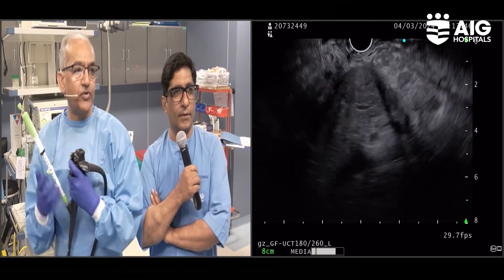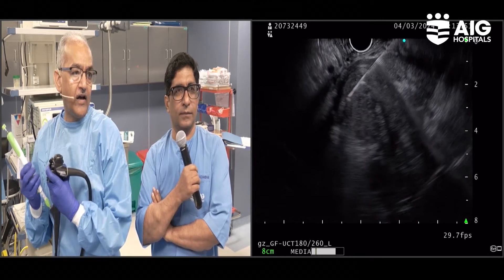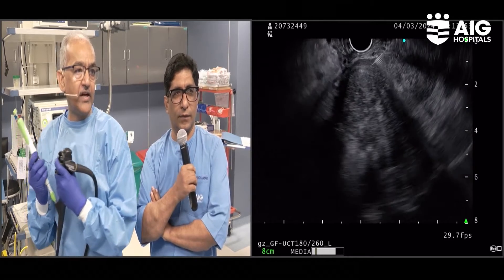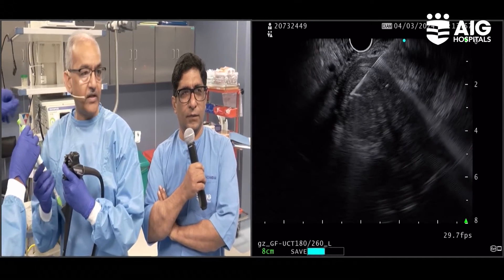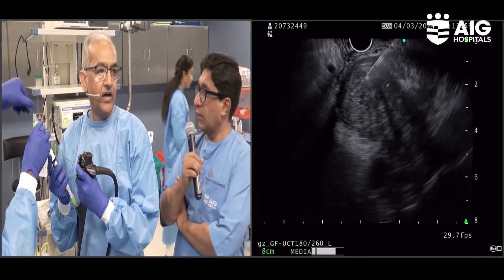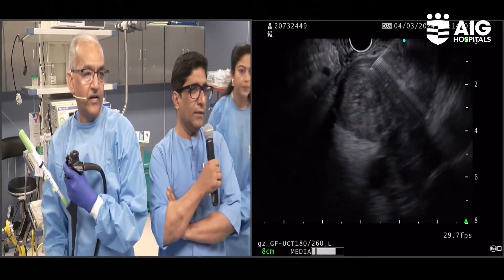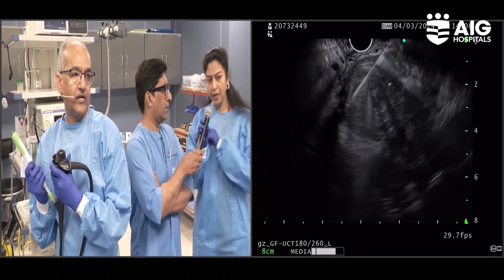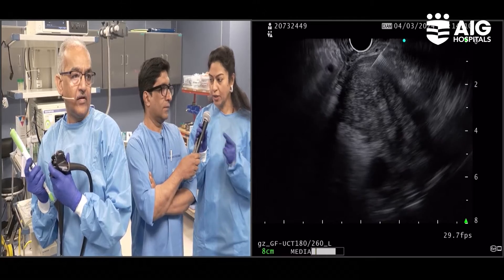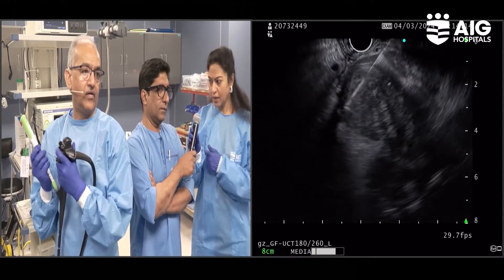Currently, pathologists have to come to the endoscopy room with the microscope and all the paraphernalia. So that's the needle inside. Can we remove the stylet please and take one quick image. So Anuradha, can we see both cytology and biopsy together? Cytology — we do the routine rapid ROSE. Parallelly we can process the tissue, and we can actually do a comparative study between the conventional and this new method.